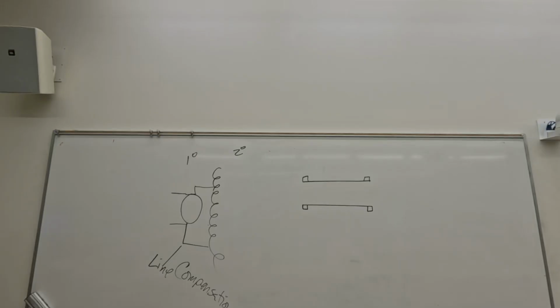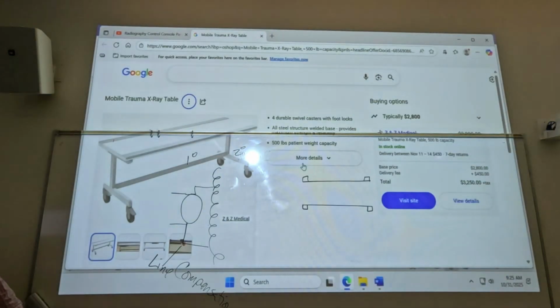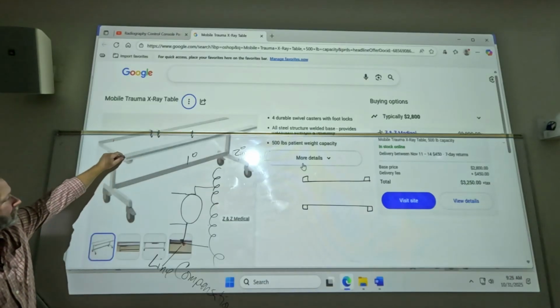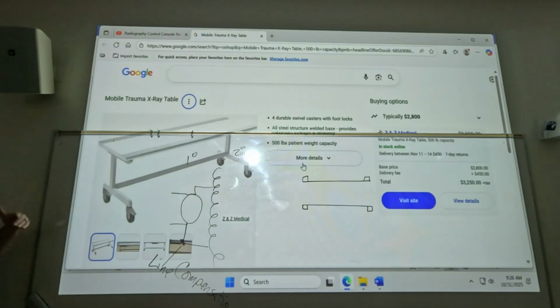So a curved tabletop would look something like that. You can see where the braces are, and it doesn't give you that three-dimensional perspective, but that brace sticks up probably maybe a quarter inch to a half of an inch. Not a whole lot, right? But is there potential for positioning issues with the bracing being on the top?